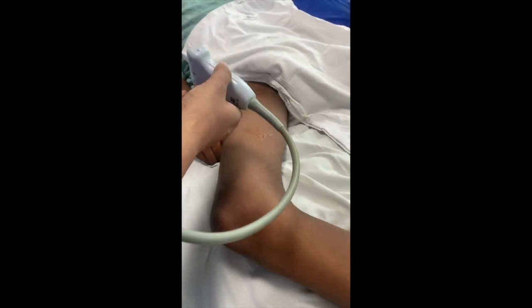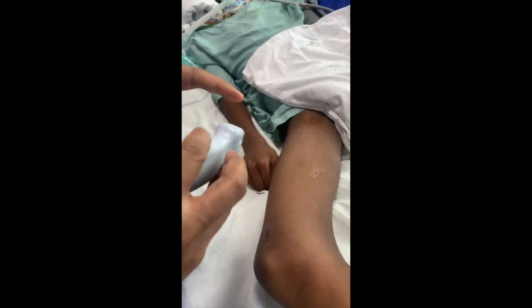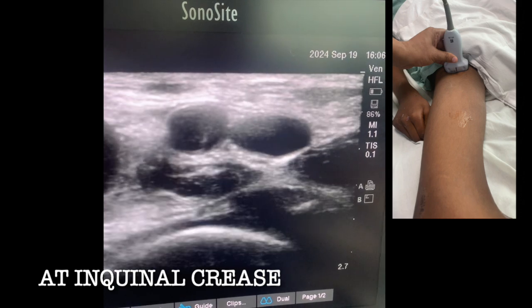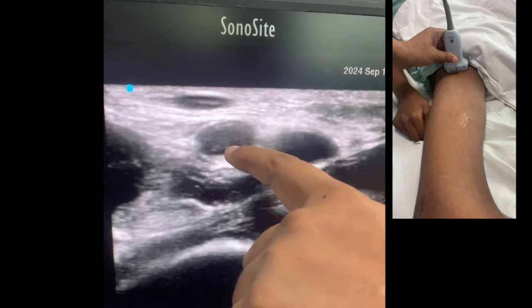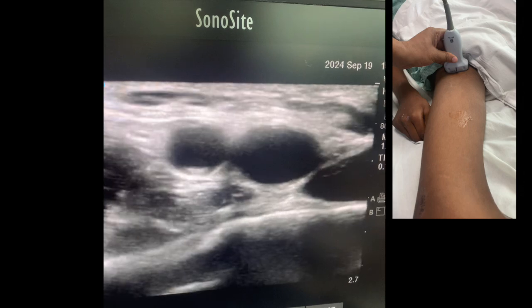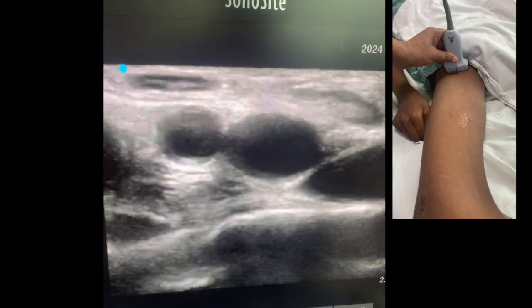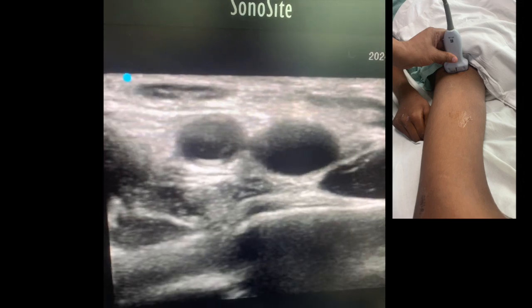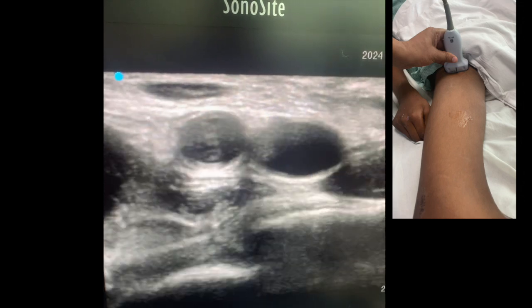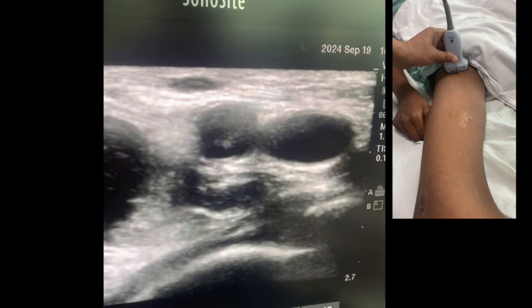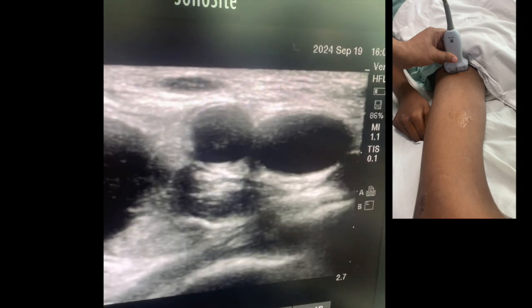I am going to start at the inguinal crease with my marker on the lateral side. Here you can see there is a pulsatile structure — this is the femoral artery — and one more structure adjacent to it is the femoral vein. To assess for thrombus in the common femoral vein, we compress the femoral vein and check whether the anterior and posterior walls are touching each other. Now I am pressing — you can see that the anterior and posterior walls of the femoral vein are touching each other, indicating there is no thrombus inside the common femoral vein.